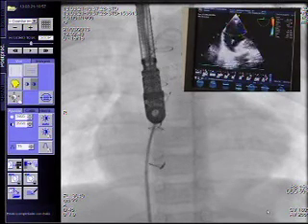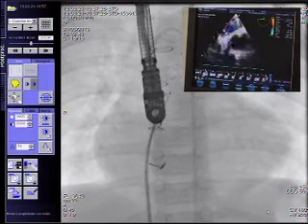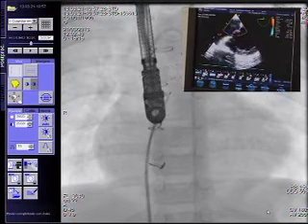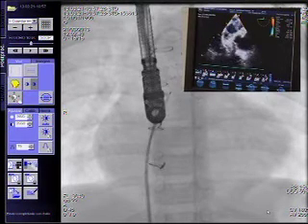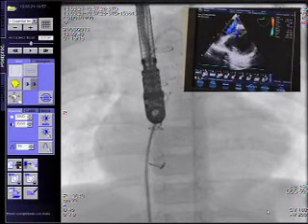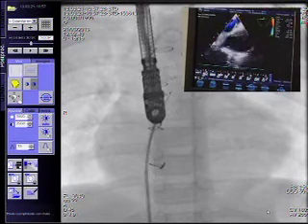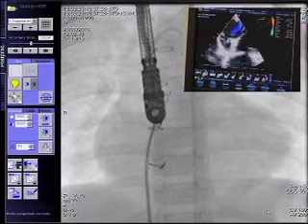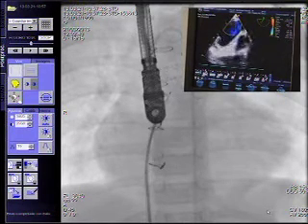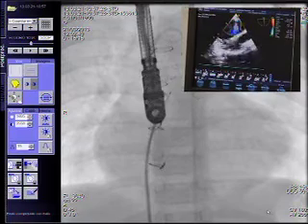This is the other hole. It looked nice. ¿Tienes micrófono? Sí. Fernando has headphones too, so he can hear you. Any comment, Fernando, about the place? I mean, it looked quite high on the AP fluoroscopy.